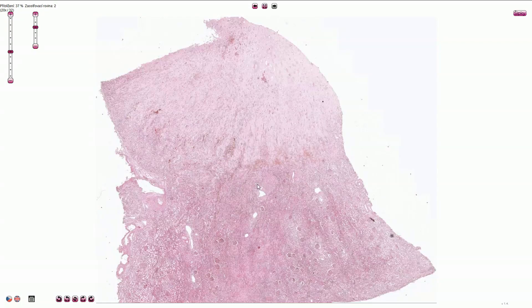Here we are looking at the slide of the renal infarction. At the bottom we have the part of the surface of the kidney. This is the cortex and here we have the renal medulla.